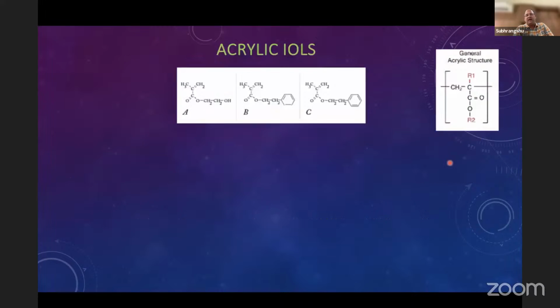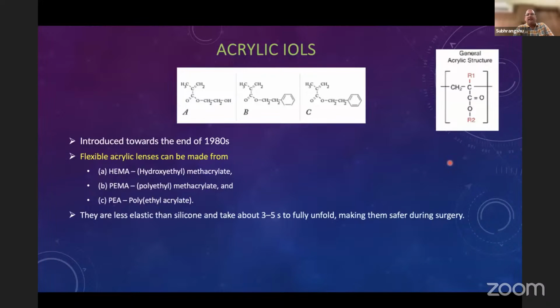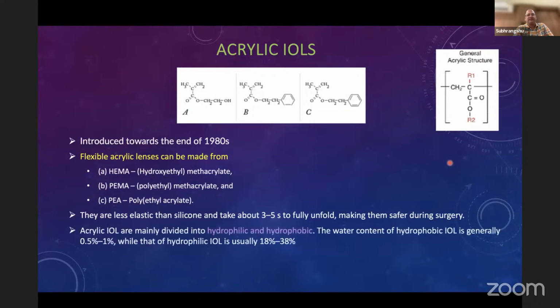than many acrylic IOLs. Now coming to the acrylic IOLs, they were introduced towards the end of the 1980s, and they are less elastic than silicone, and therefore they will take about 3 to 5 seconds to fully unfold, making them safer during surgery. They can be hydrophobic or hydrophilic. Hydrophobic IOLs have water content of about 0.5 to 1%. Hydrophilic ones have a water content of 18 to 38%.